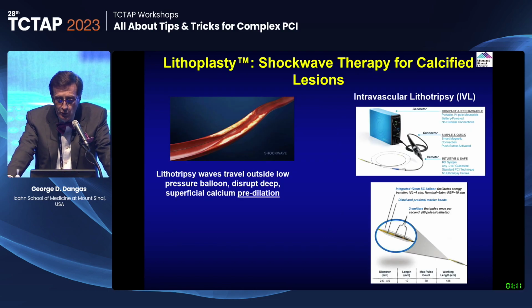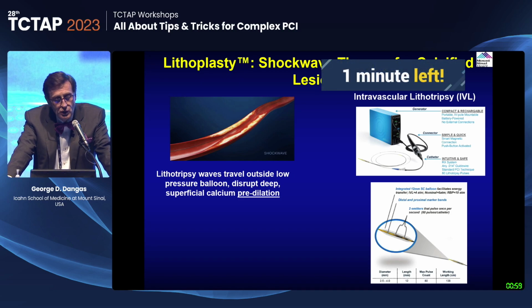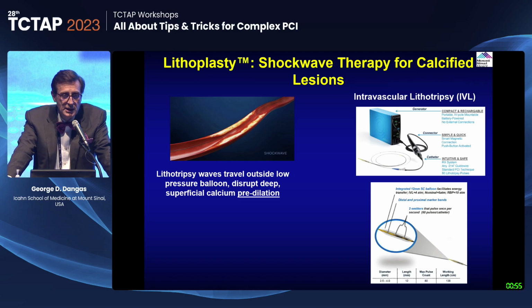Ultimately, we have a new device that came about. It's a balloon, and it's very handy in that many people are not so facile in utilization of the atherectomy devices, may be concerned or even quite a bit scared about them if they don't use them often.